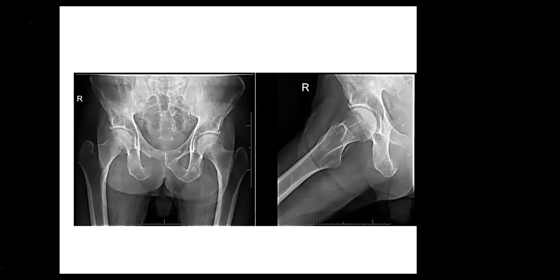When we describe a bone lesion on the radiographs, after your description, you should really commit to whether this is an aggressive lesion or non-aggressive lesion. So please remember this, because we do not necessarily recommend MRI scan for lesions that are non-aggressive on the radiograph. So when you request an MRI scan, there is a reason why you request an MRI scan.